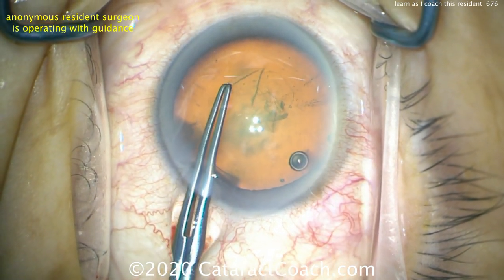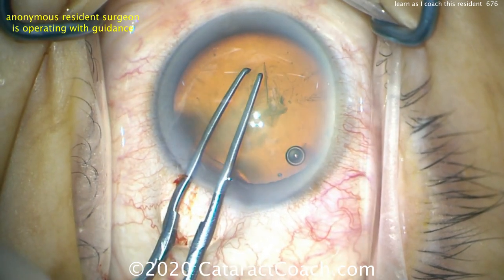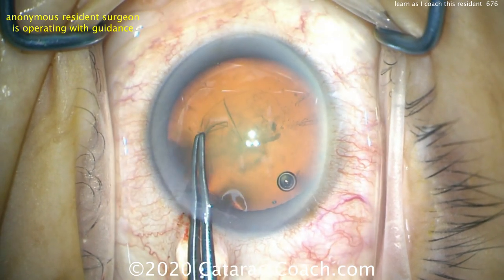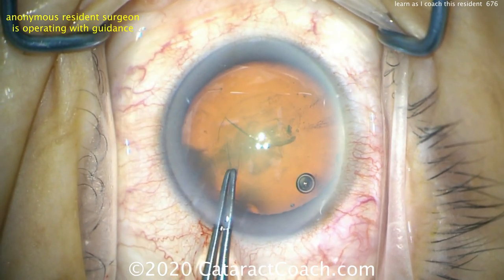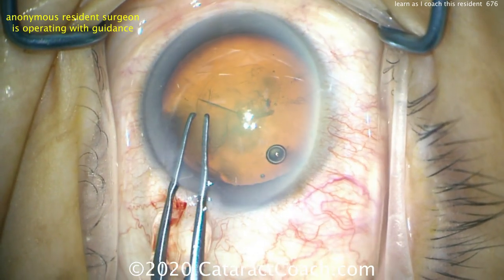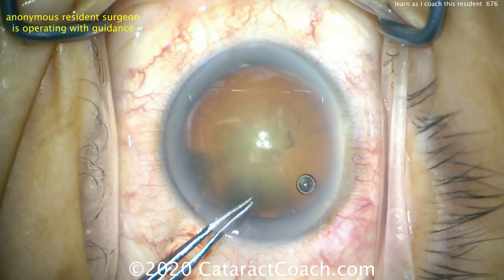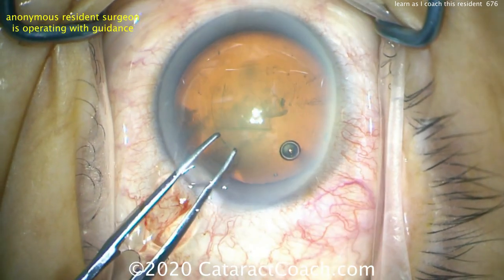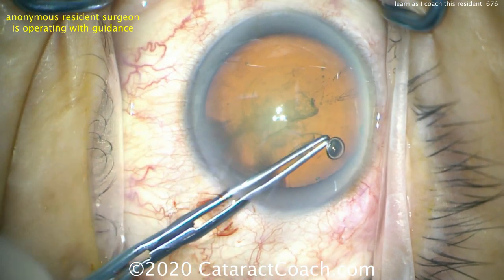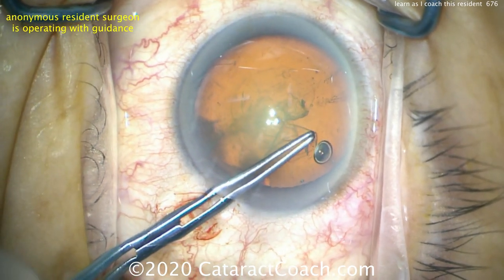Now the key with the forceps is you definitely have to pivot within the incision. You want to keep this eye still and in primary. Pivot in the incision. Don't let out too much viscoelastic. That's a good size — you're doing great, keep it going. Now don't make it too small; a baby rhexis is going to make the surgery difficult. It needs to be bigger — that's better. Bring that out. Fantastic. Good job pivoting. If the tips of the forceps move and trace a perfect rhexis, the flap will just follow. Now here's the time to flip the pivots — tips go one way, base goes the other. Very nice, doing a great job. Take your time.